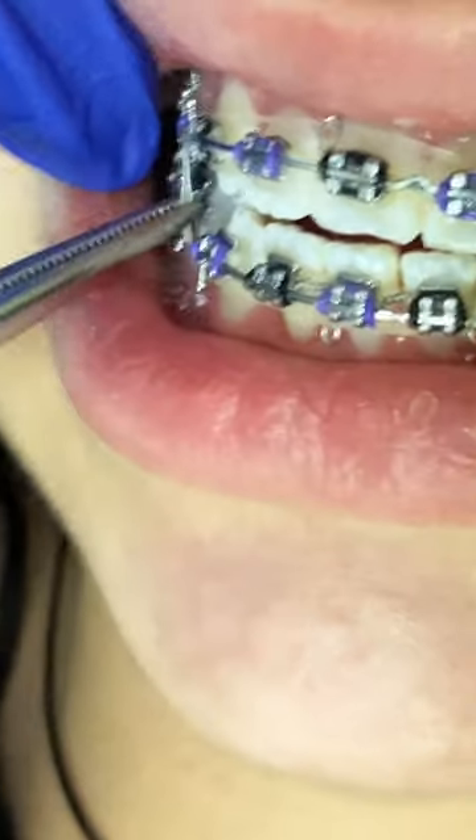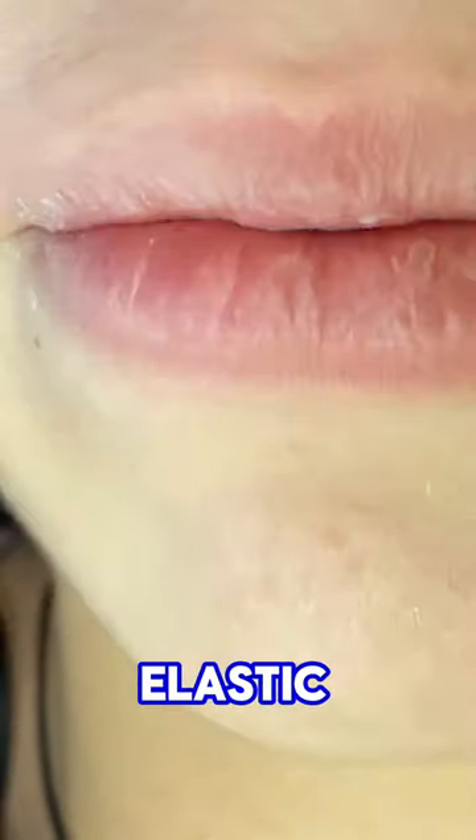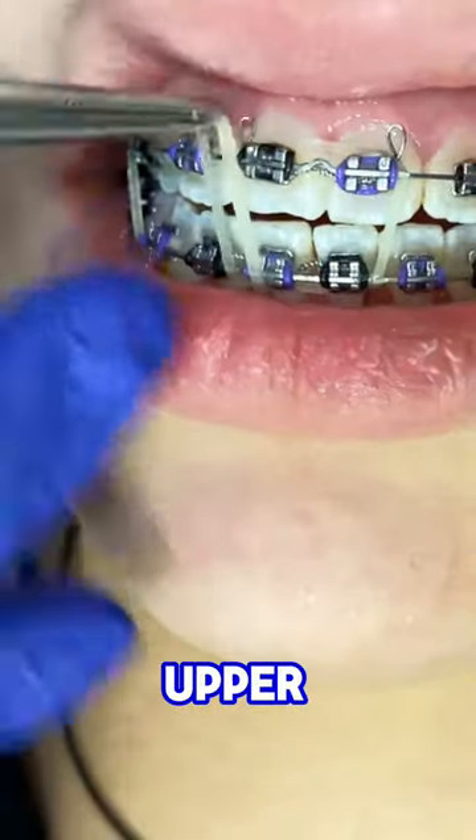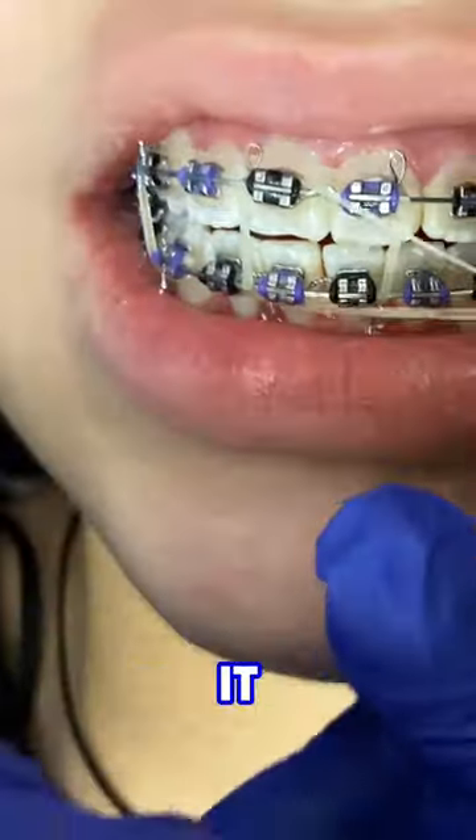Then you get the other elastic and hook it from the upper right one to the lower right one, and you cross it over to the upper left three to the lower left three.